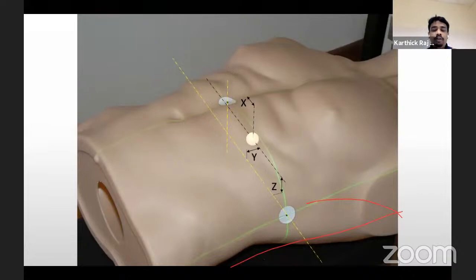So always make sure you move correctly, write it down, whether it's a left side tumor or a right side tumor, and always go with your couch vertical distance. From the couch vertical, just take a scale to your laser, since my couch vertical is fixed. Always check the SSD. If you don't have an imaging system, and most of the cobalt centers don't, they just move the isocenter according to the treatment planning system. Always cross-check all the parameters, your SSDs, your right side or left side, that you moved your isocenter properly. Everything has to be checked.